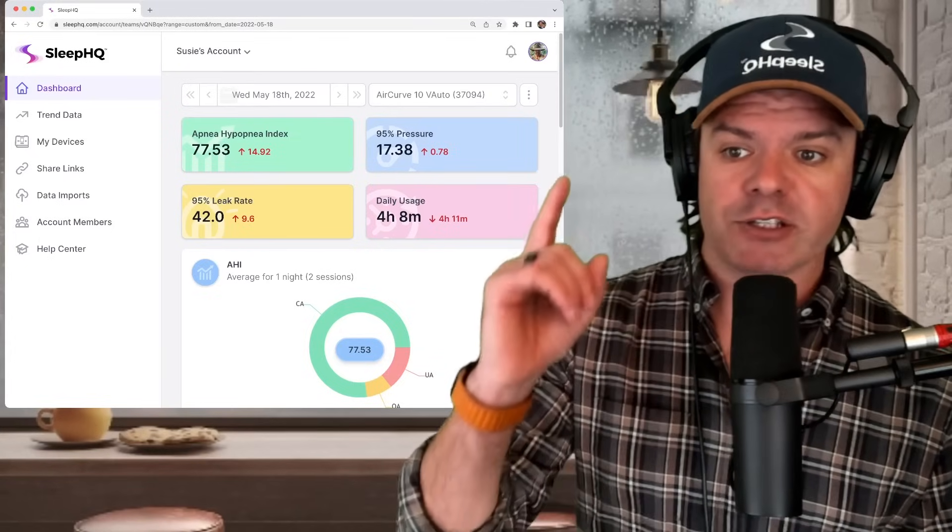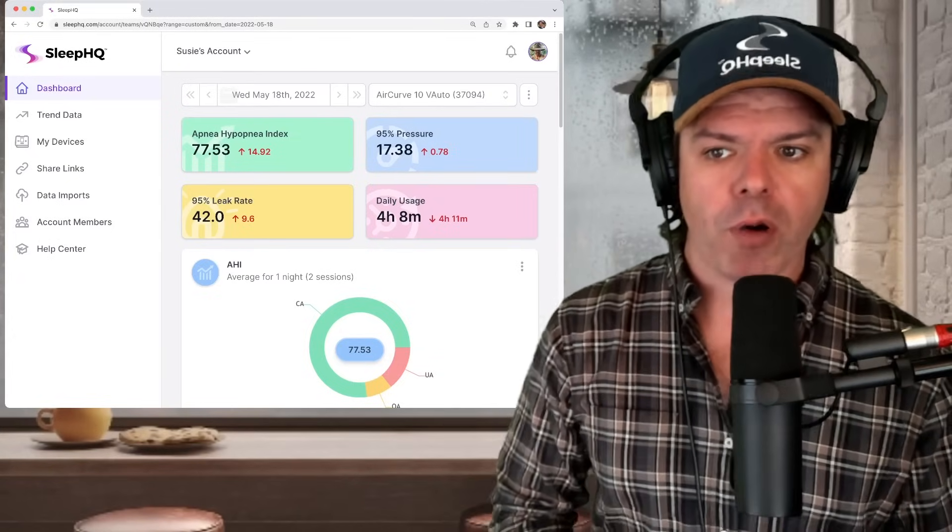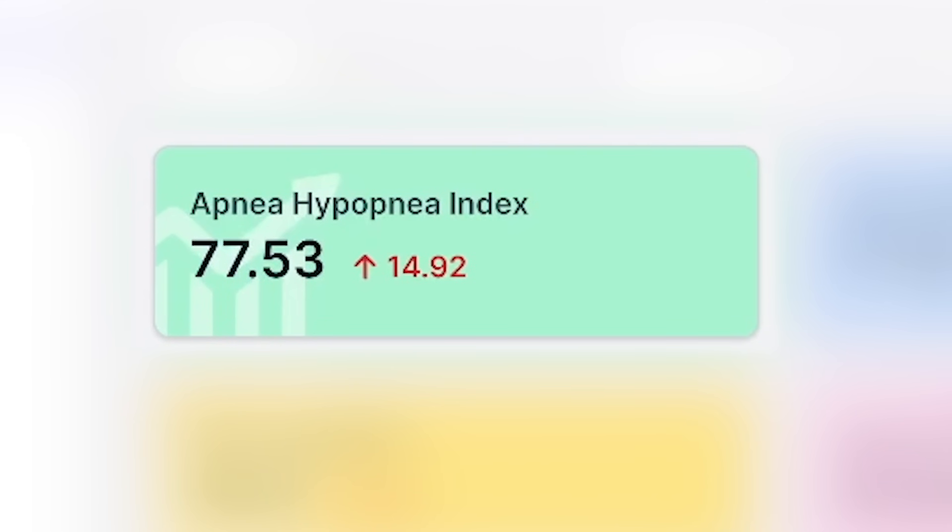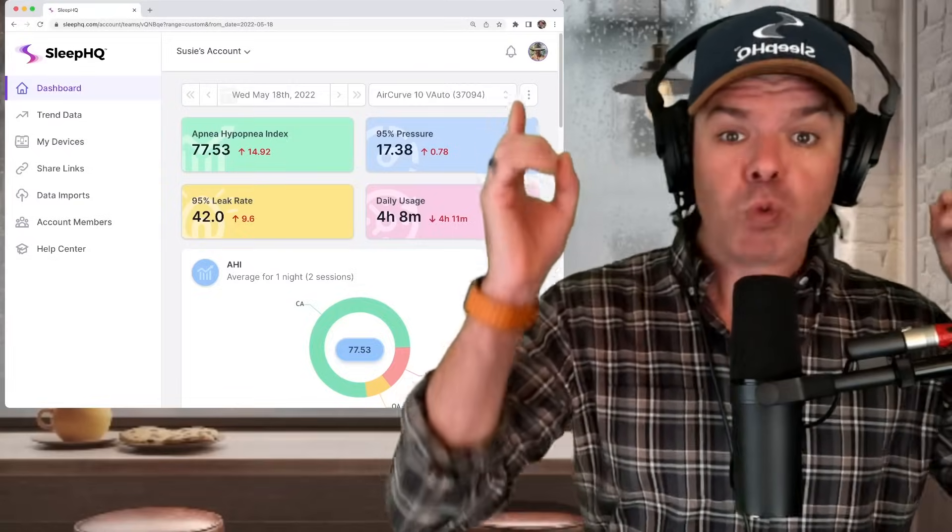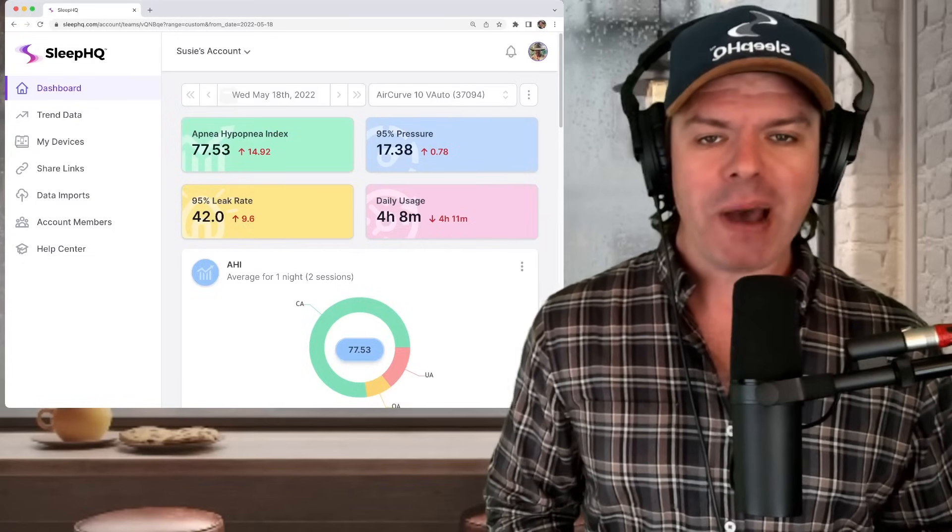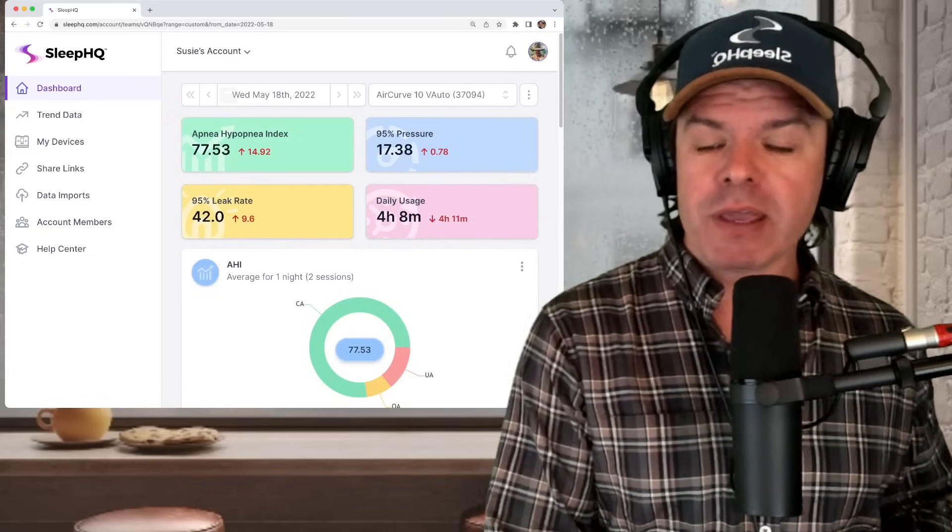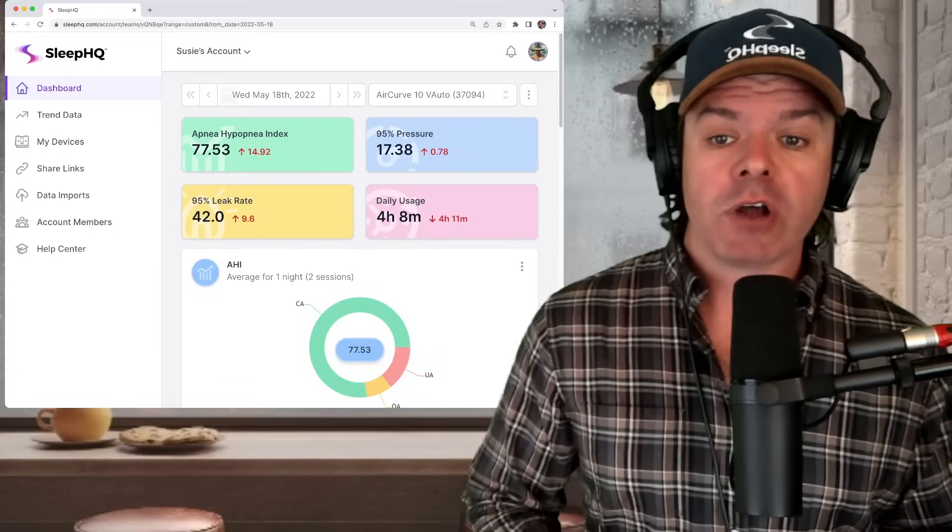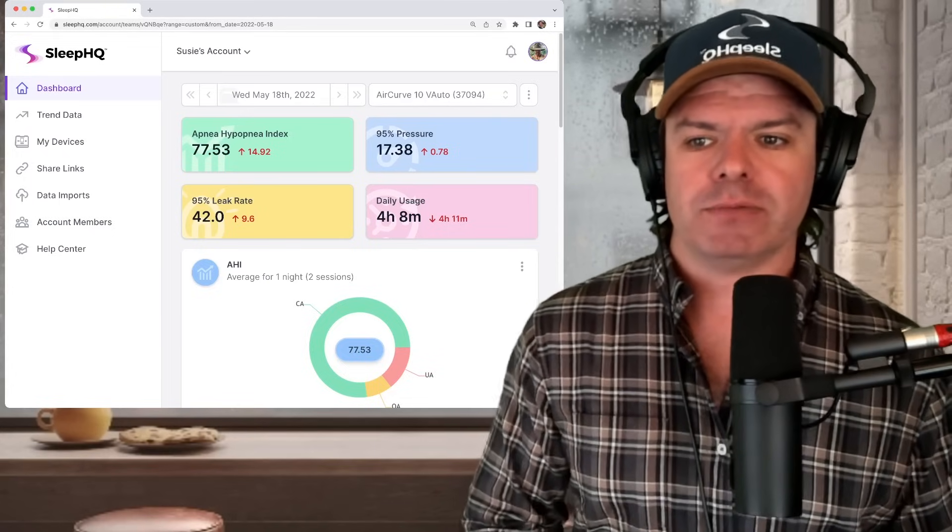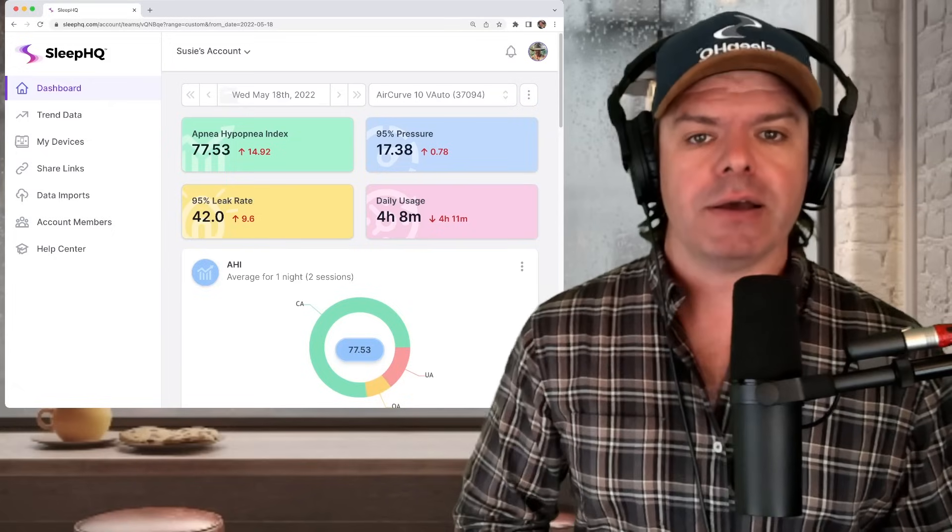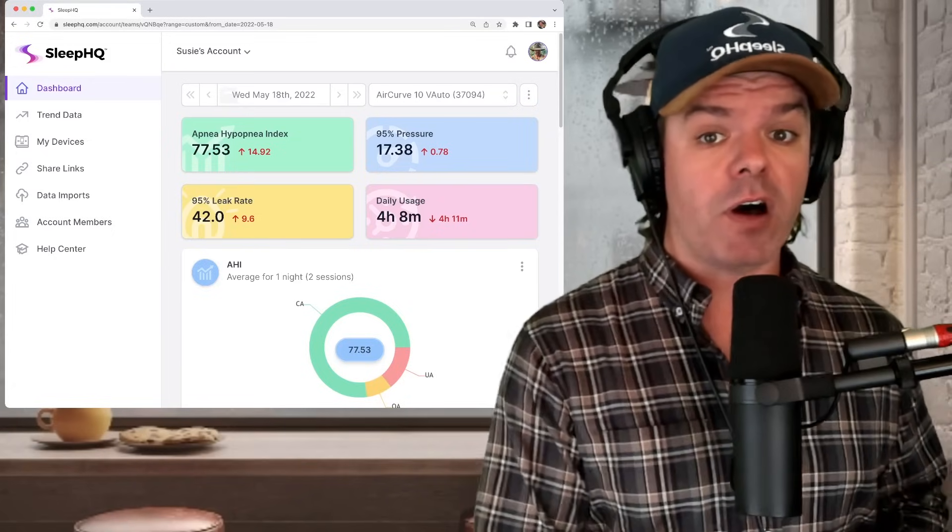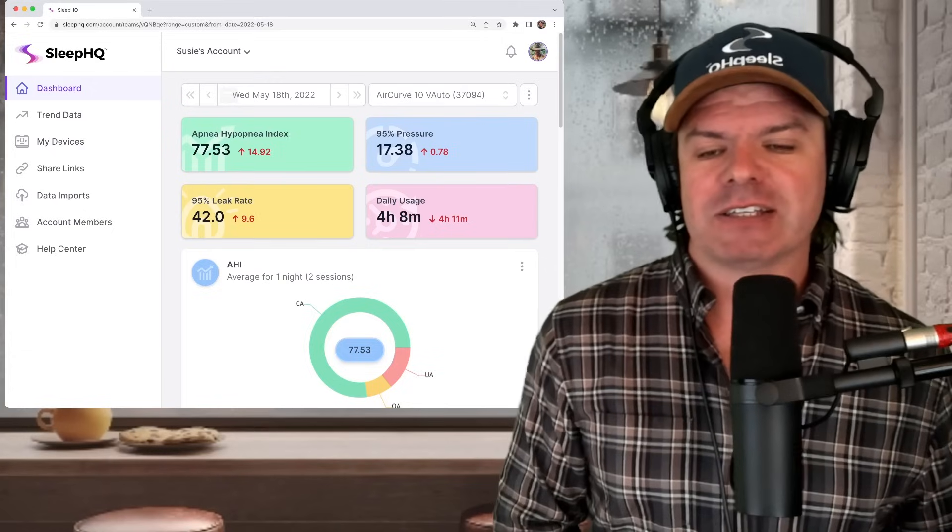Check out this crazy high apnea hypopnea index, 77.53. That is enormous. And that's with therapy. Can you imagine what it must be without therapy? It must be well over 100. That's insane. Let's dive a bit deeper and see exactly what's going on. Why is this number so high? The goal is to try and get it less than five. We're a long way off that.